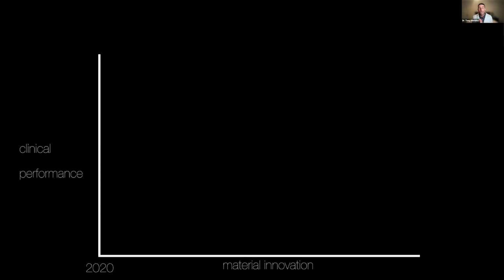And like I said, the materials I'm talking about are these first and second generation printed crown materials, and we are now starting to see 1-year and 2-year follow-ups of those cases that have actually been in the mouth.